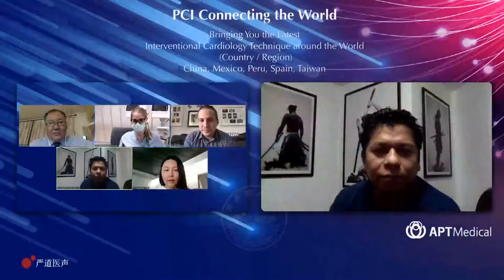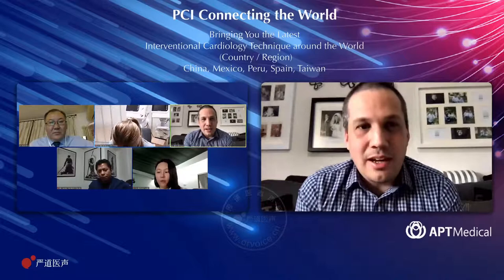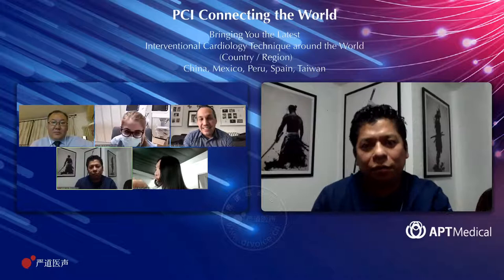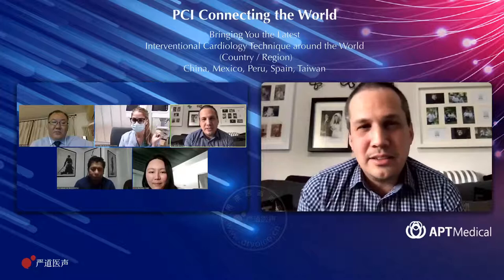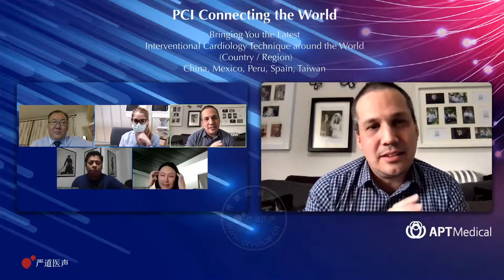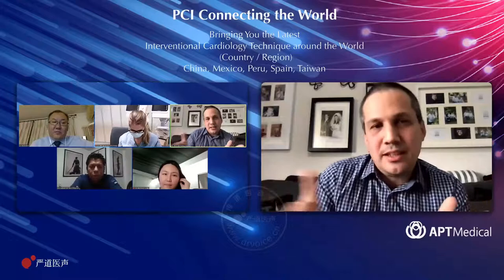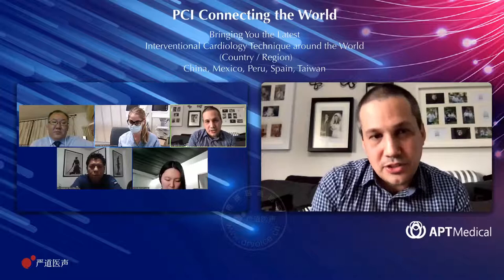Yeah, I mean, we should have done IVUS, but as you know, our reality in the countries of South America. I know the situation in Latin America, yeah. In Mexico City, we have the same situation with IVUS. We do IVUS in the institute, but it's a national hospital, so they buy supplies, and then there are some periods of time where we don't have them. So at that point we didn't have IVUS. But yes, your comment is really good, because we should have ended with an IVUS to see the position of the stents. But the angiographic result is very nice.